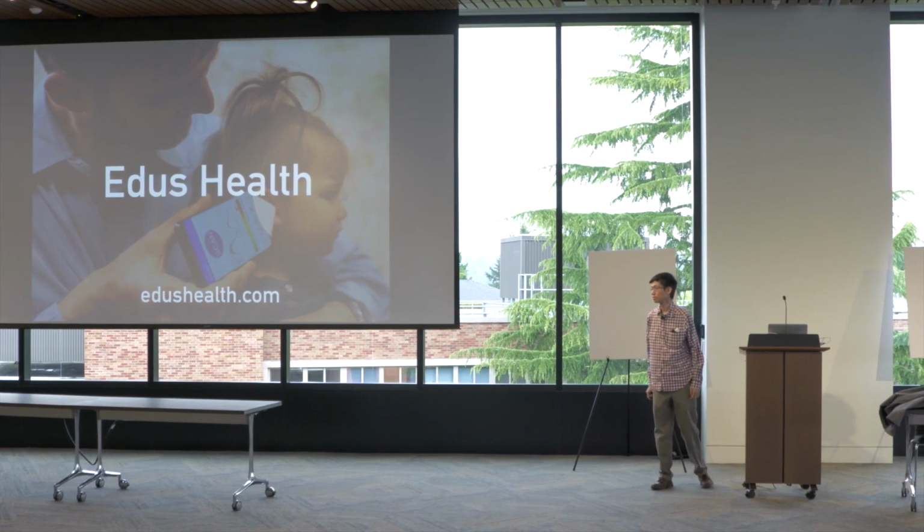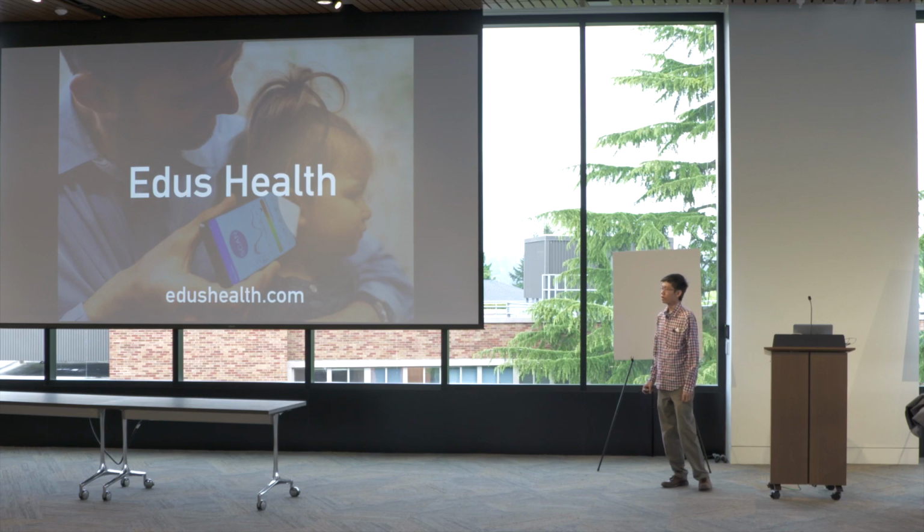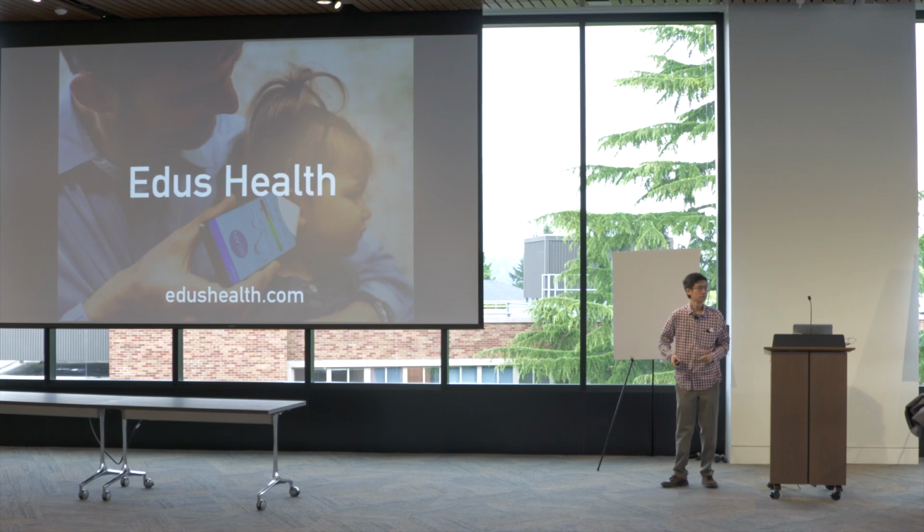Is there any specific reason why you used the iPhone 5s apart from availability? There is no specific reason that we used that. The important thing, though, is that the microphone and the speaker have to be on the bottom of the phone. But in fact, all modern smartphones have that configuration for noise cancellation. If you go from the very first iPhone to the current iPhone, their configuration is the same. So this will really work across a wide variety of smartphones.